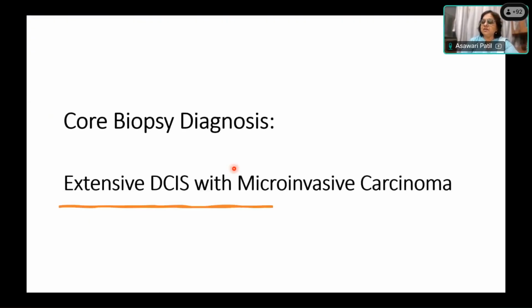And the diagnosis of invasion is essential in biopsy. So what is the further treatment? Anybody knows? Is there any change in treatment if we call it DCIS versus invasive carcinoma? Yes, ma'am. What is it?